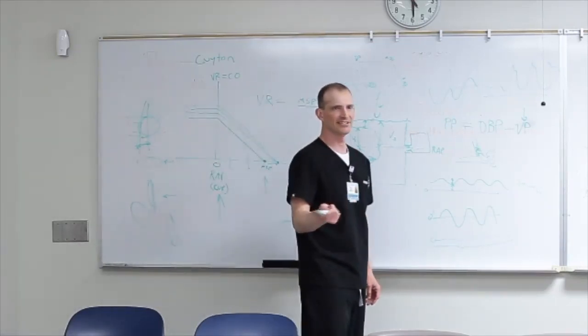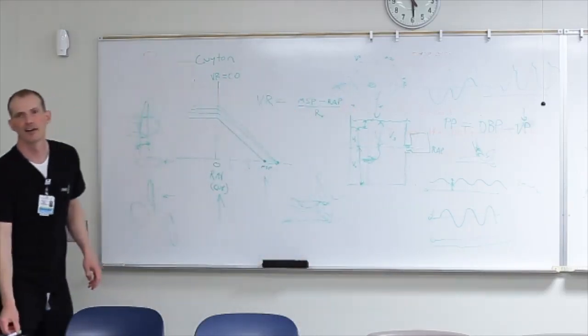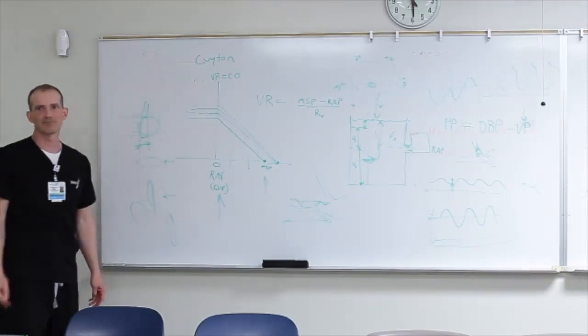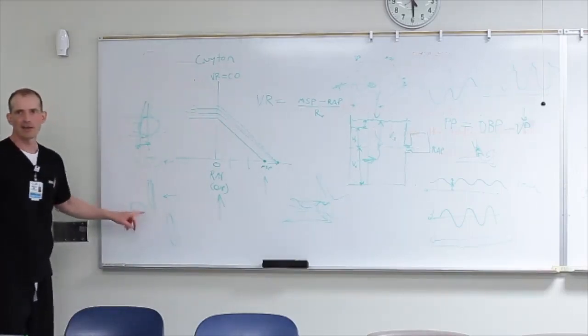Any questions? How about if we can't see the IVC anteriorly for some reason? You can come around this way and look. It's okay. You're going to get a little bit more of this stuff going on that way.